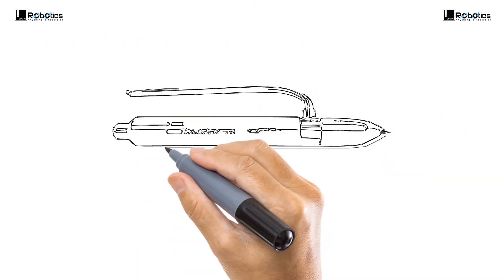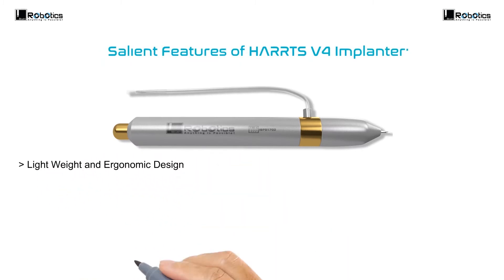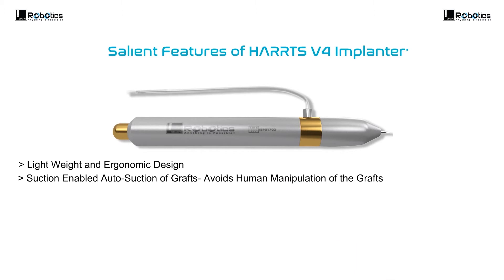Salient features of the HARRTS version 4 Implanter. Lightweight and ergonomic design. Suction-enabled auto-suction of grafts avoids human manipulation of the grafts while engaging and during implantation.